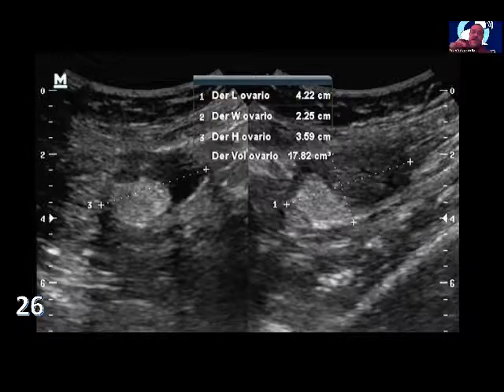It's not like augmenting a bad picture, but having a better picture.